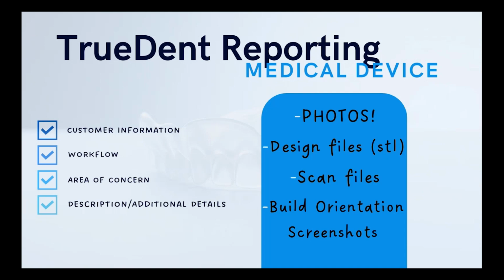Back again to photos, so important. The number one tool that we're going to use. If you don't send photos, we're going to ask, and it's just going to take longer to get your issue resolved. Design files, the STLs of the actual models that you're experiencing whatever issue with, we need those as well. And they're actually requirements. These are all requirements for the medical device reporting. FYI, I should have said that at the beginning.